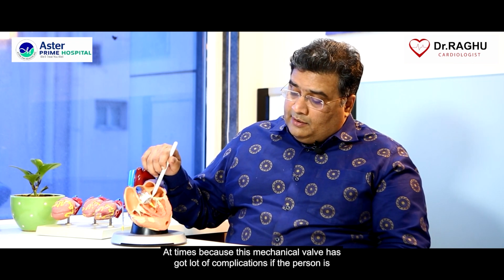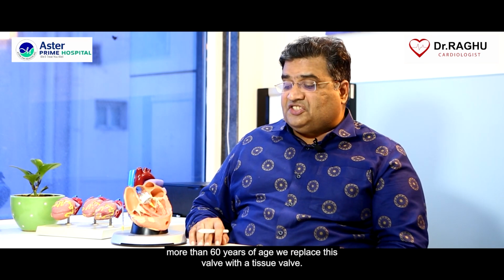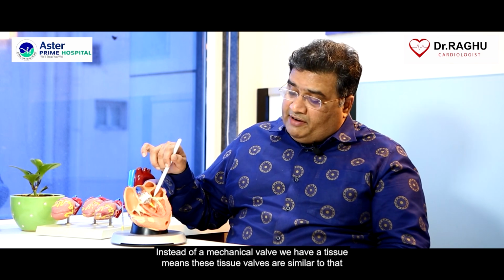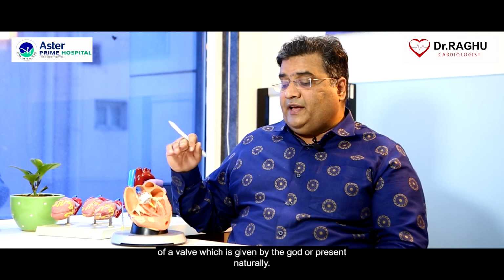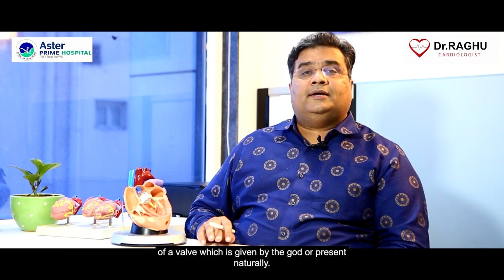At times, because the mechanical valve has a lot of complications, if the person is more than 60 years of age, we replace this valve with a tissue valve. Tissue valves are similar to a valve given by God, or present naturally.